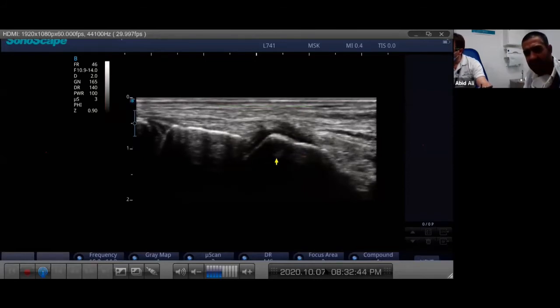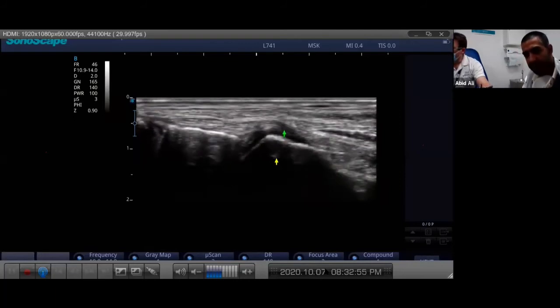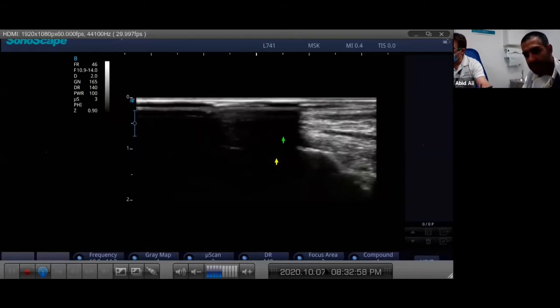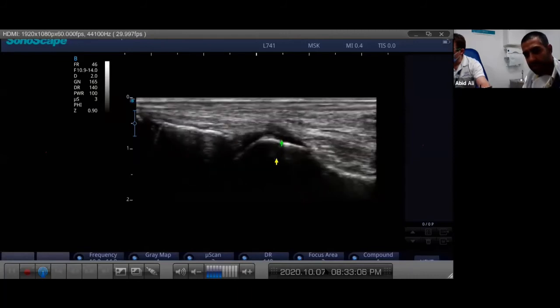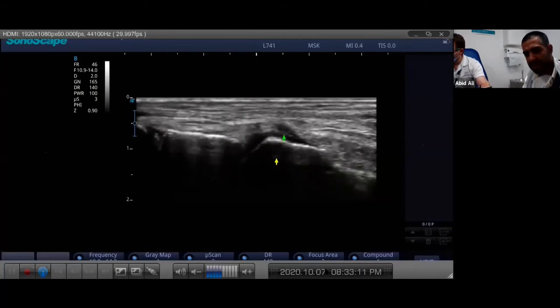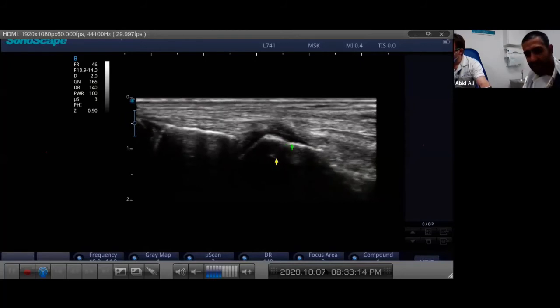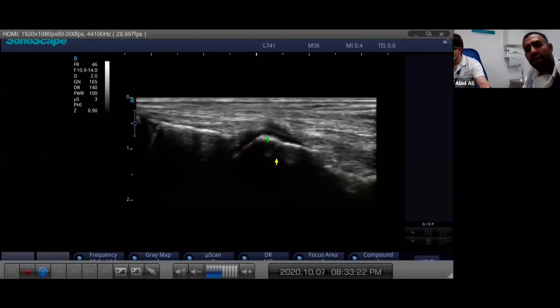Would you report that, Adrian? I suppose I'd mention it - 'trace of fluid seen in the talonavicular joint.' When we looked at it from the more medial side we didn't really see anything - it might be anisotropy. Just angling up there it brightens up a little bit, but I think there is a trace of fluid under the ligament. The ligament looks maybe slightly thicker - possibly you've been kicking a lot.